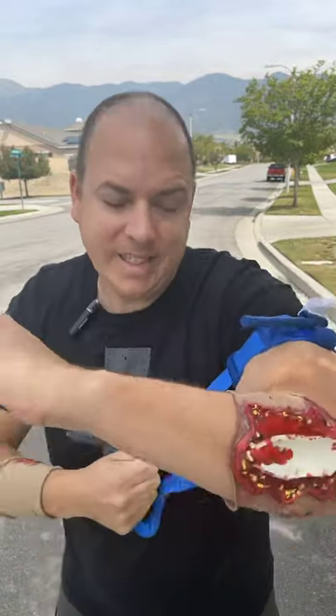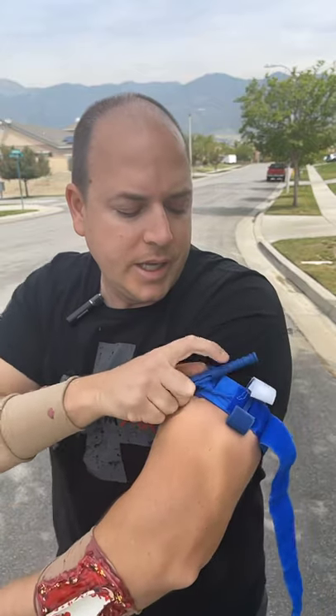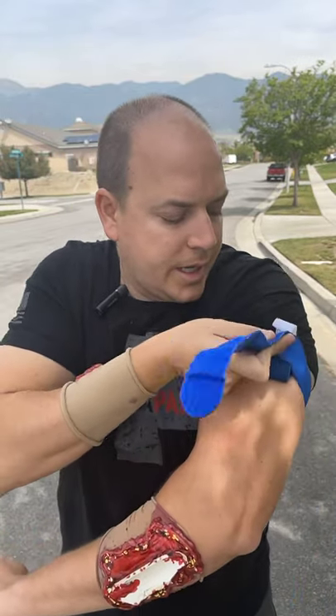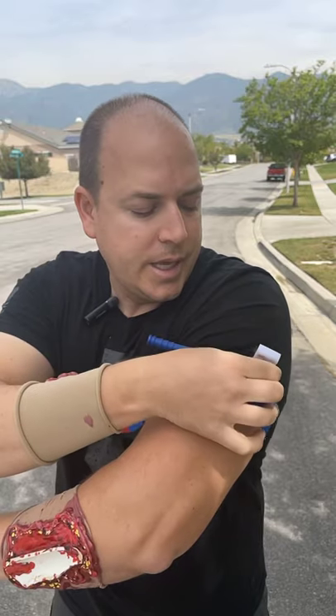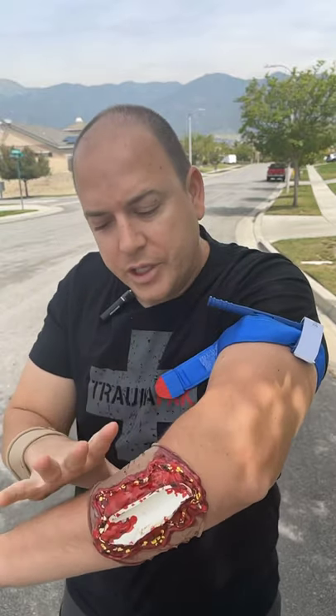I'm going to pull as tight as I can. So I go high and tight, bring it all the way around, and start turning this rod in any direction until there's no more bright red blood from this wound. I can bring this strap back — some people like to go through it, but I'm okay with just like this — and then the time strap goes over it. This is going to basically stop all circulation to this arm.